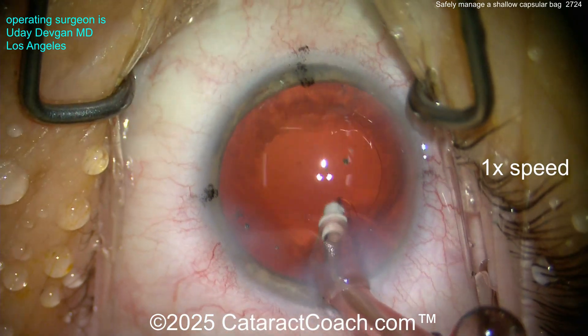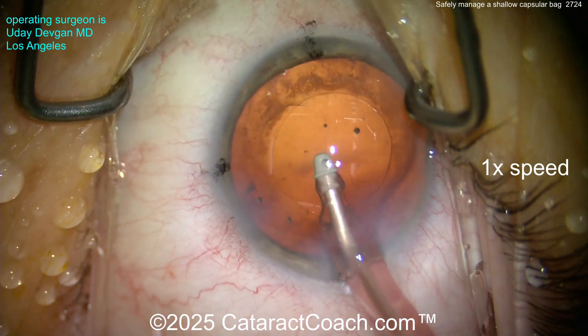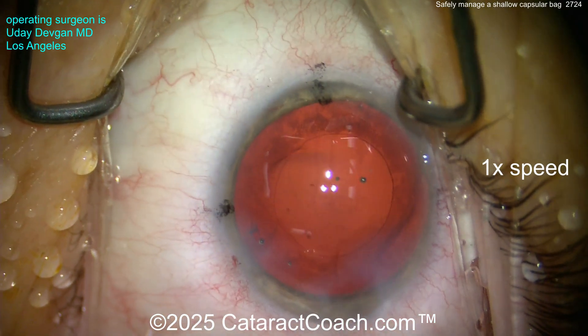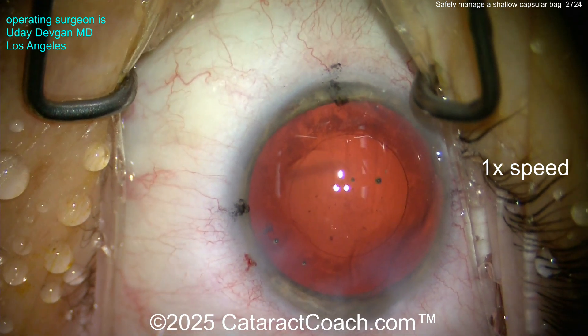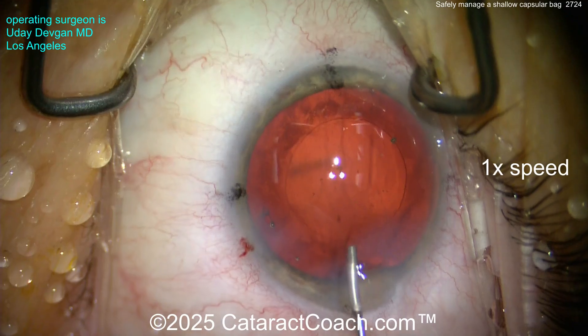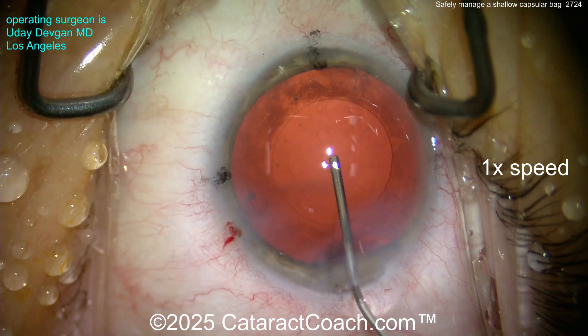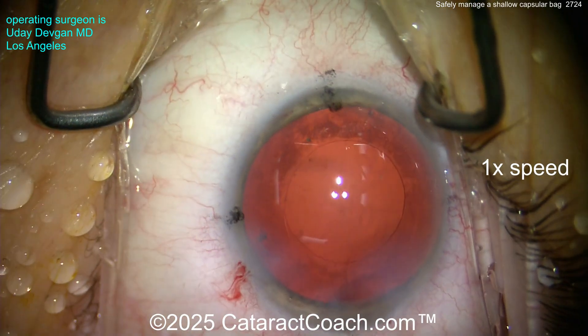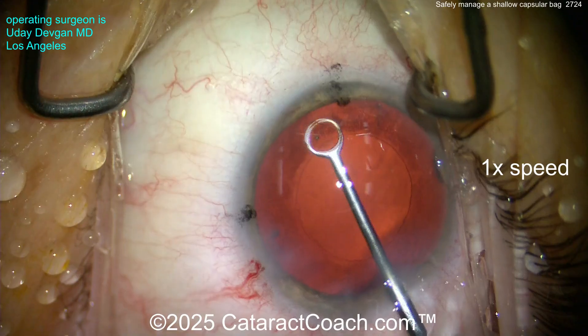I'll get all the cortex out pretty easily. But look behind the posterior capsule — you can see tiny lens material in front of the anterior hyaloid face. How did it get there? The loose or gappy zonular support. Now let's put the viscoelastic in — cohesive — get a good deep fill and give it some time. That can push out some of the fluid.